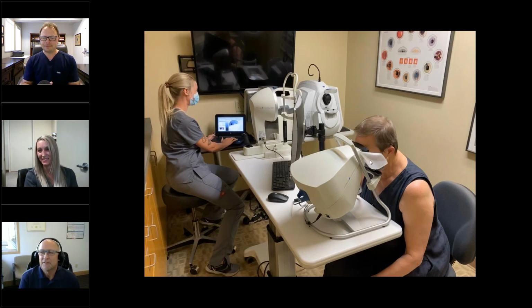Do you ever screen patients with the Smartfield, or is all of your screening done with the FDT? So we use the FDT as our screening instrument, but it's really just for clinic flow. If we had the ability or the need to just have one instrument, this would be it because it can do everything. Our special testing room, which you see on the screen there, is in use half the day or something. They're always scheduling patients. So using the Smartfield as a screening tool would get in the way of patient flow out in the clinic, because screening is performed in kind of a pre-testing room.